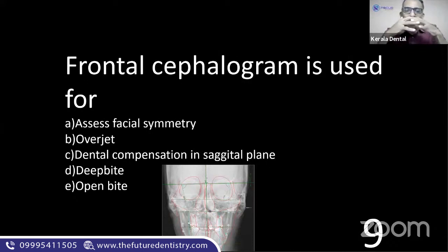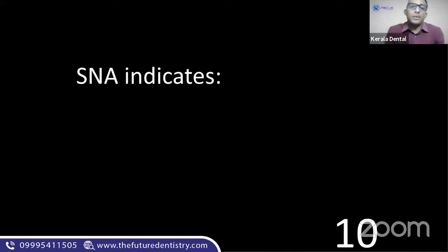Expansions, unilateral expansion, bilateral expansion, all that is what we are talking about when we are talking about frontal cephalogram.